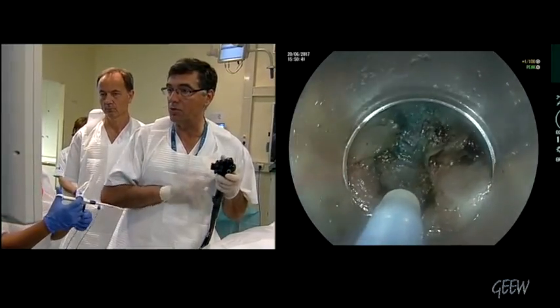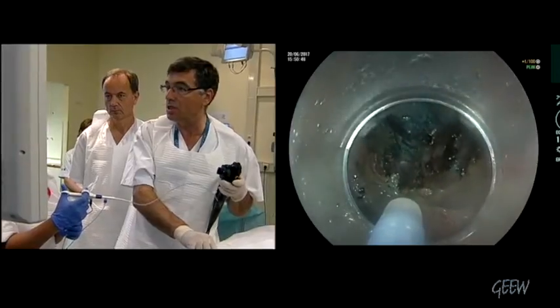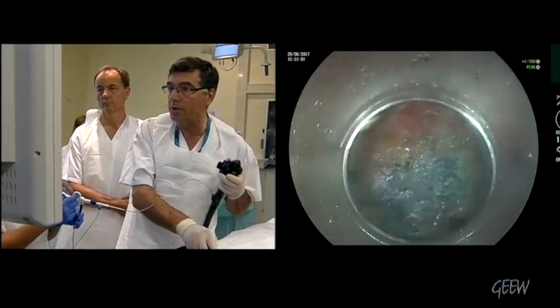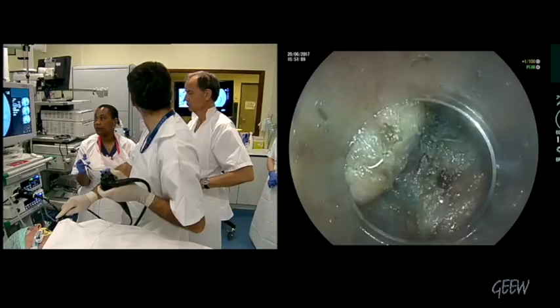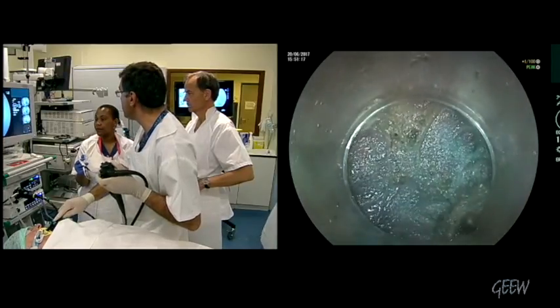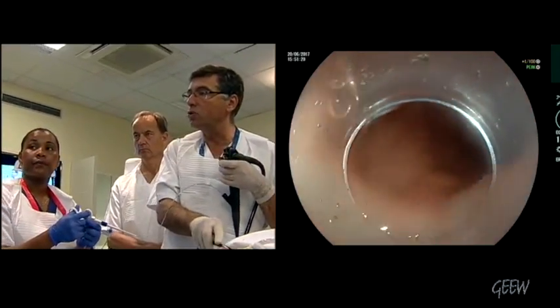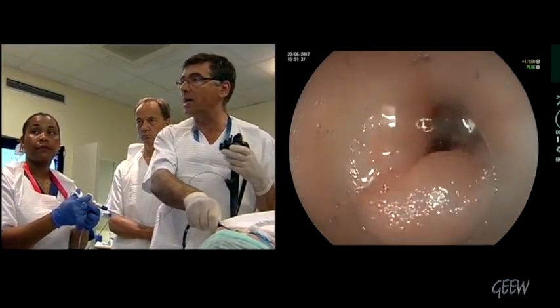I think we have nearly finished. We are going to check. You see the blue infiltration of the mucosa and of the pylorus. I just want to see if there is no mucosal injury in this part. The blue part has crossed the pylorus — good, very good. This is the mucosal entrance, this is the tunnel, and this is the myotomy — intramyotomy and pylorotomy. The complete pylorotomy and myotomy are done. My advice is always: take care not to do any injury in the submucosal on the bulb part.